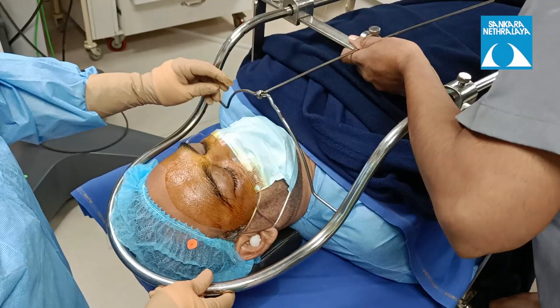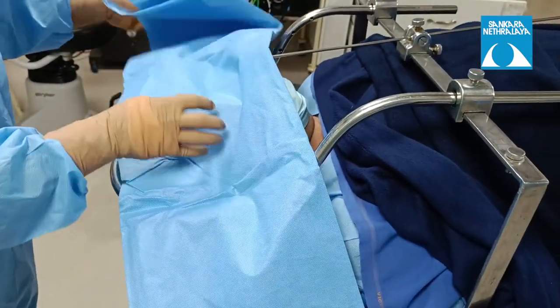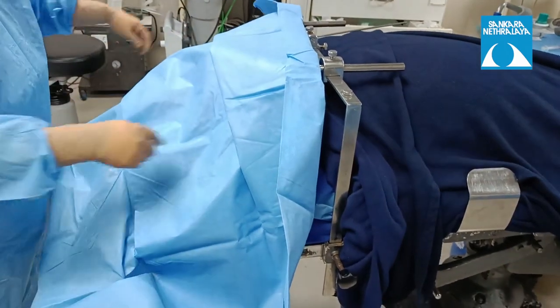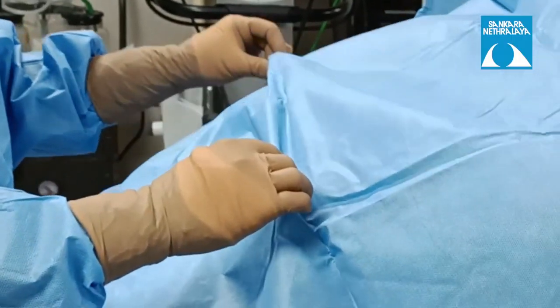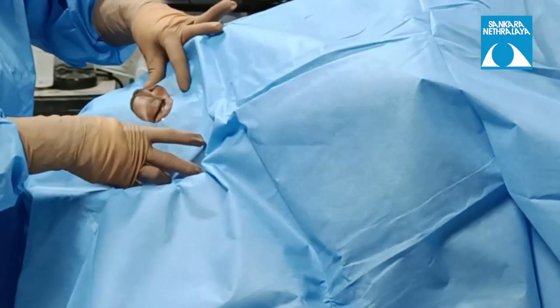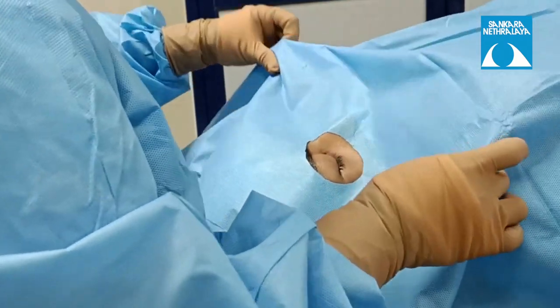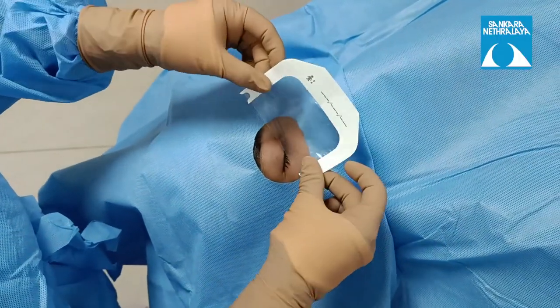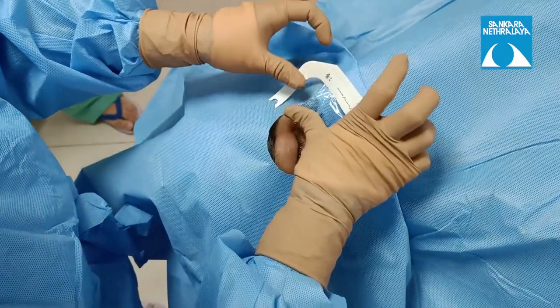By this time, the iodine solution has almost completely dried from the forehead and ocular surface. The sterile folded drape is then placed around the ocular surface, sticking it from the medial to the lateral side. The drape is unfolded carefully to make sure not to touch any unsterile surrounding area. The medial side can be augmented with Tegaderm drapes to help achieve a good closure around the medial canthus.